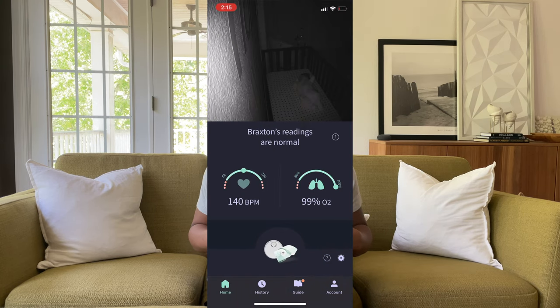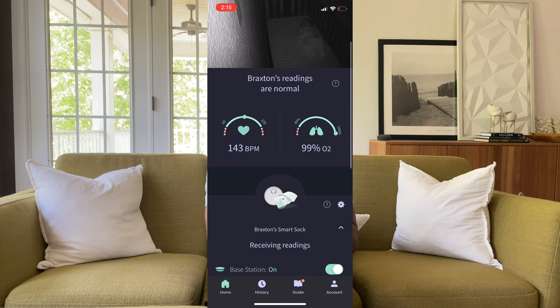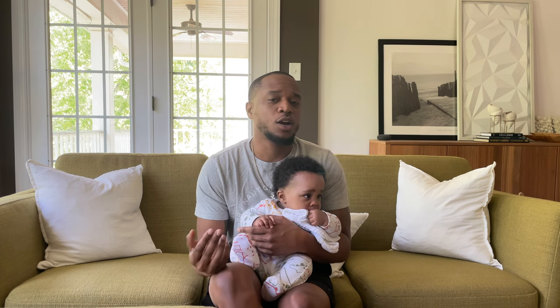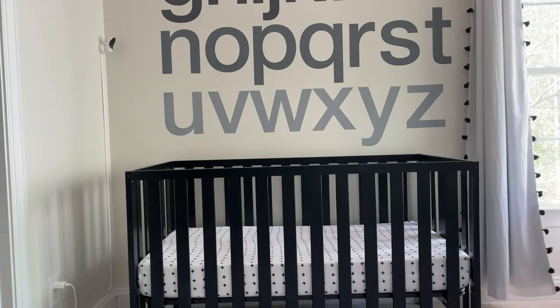We almost exclusively use the app on our phone for this information — it gives us more precise data, telling us almost the exact oxygen levels as well as his heart rate. The Smart Sock and charging dock comes by itself or as a duo system. We got the duo system, which also includes the two-way baby monitor. The monitor has very good video quality and audio, and it's called two-way because we're actually able to talk back into his room through the phone app.